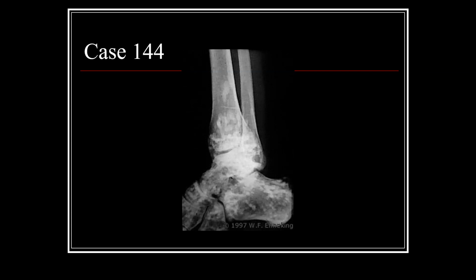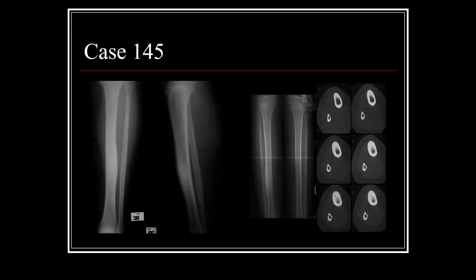This is something where you might be thinking about some sort of a syndrome, or potentially miliary infection or something of that sort that could produce osteoblastic disease. This far distal, it would be less likely to be metastatic disease. So again, you'd probably be thinking of some syndromic or other sort of thing as a consequence of that image.